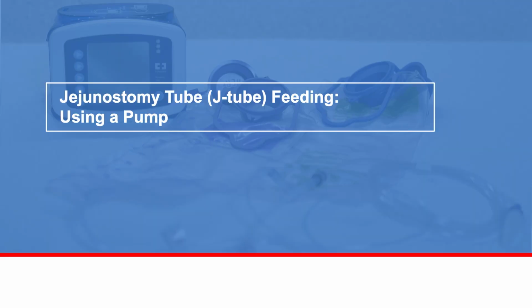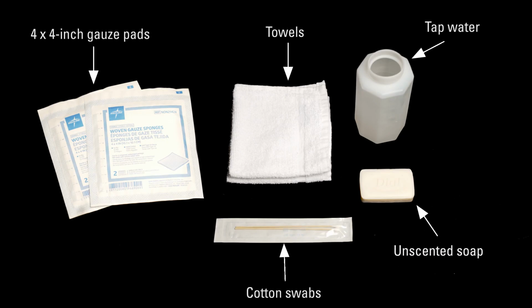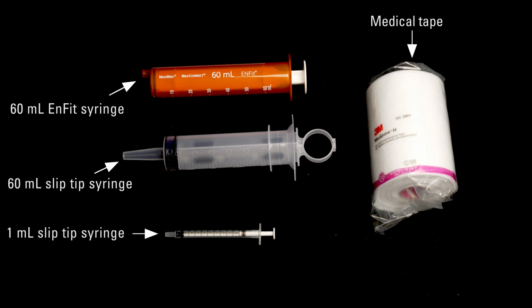It's important to maintain your Jejunostomy-tube, or J-tube, as instructed by your MD Anderson Cancer Center care team. To do so, you will need unscented soap, tap water, towels, cotton swabs, 4 by 4 inch gauze pads, medical tape such as Medipore, a 1 milliliter slip-tip syringe, a 60 milliliter slip-tip syringe, and a 60 milliliter ENFit syringe.